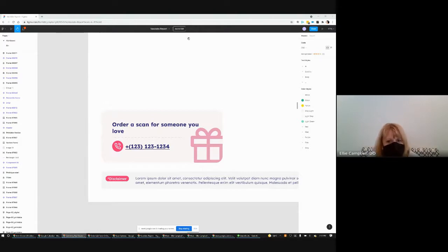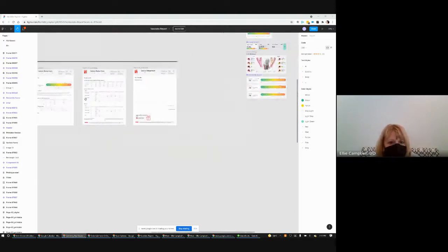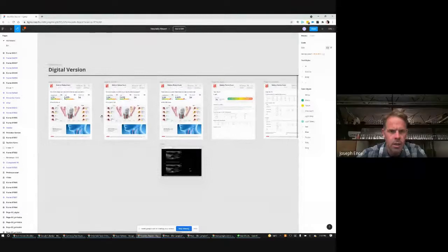So show me this report. Do you have one that's serial? Do you have serial tracings? No, we're just coming. Okay, so here's the bad news. The techs are getting new machines, and it's about 20% different on the IMT measurements. So we were going to try and figure out a way to cheat it, but we scrapped that whole idea and just fess up to you that we're upgrading technology. I'm sorry.